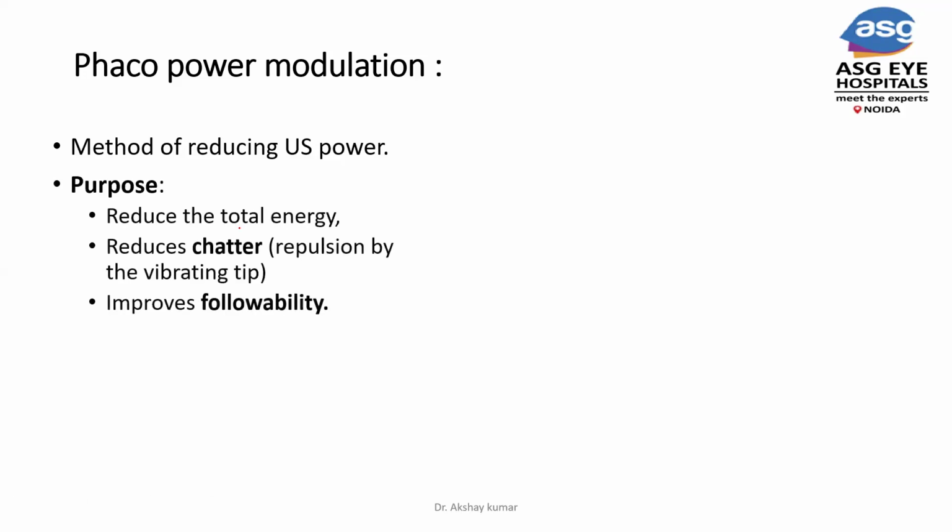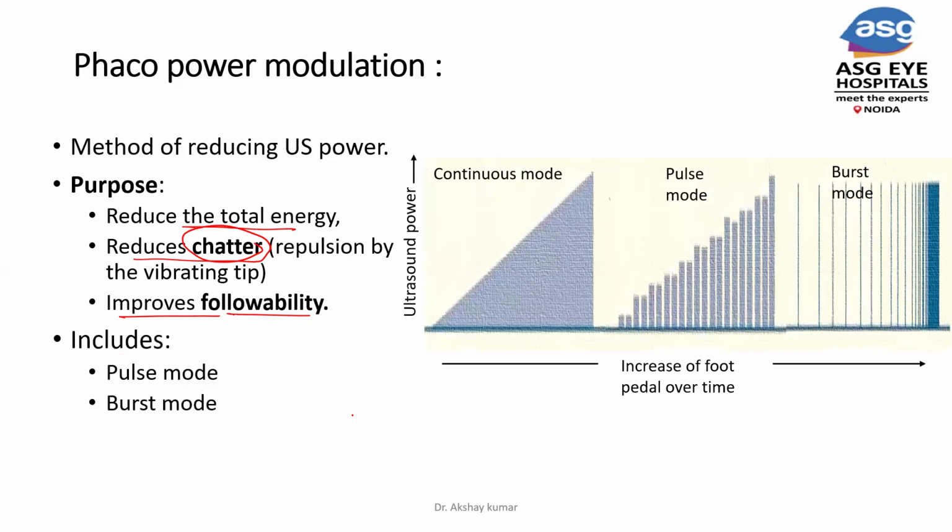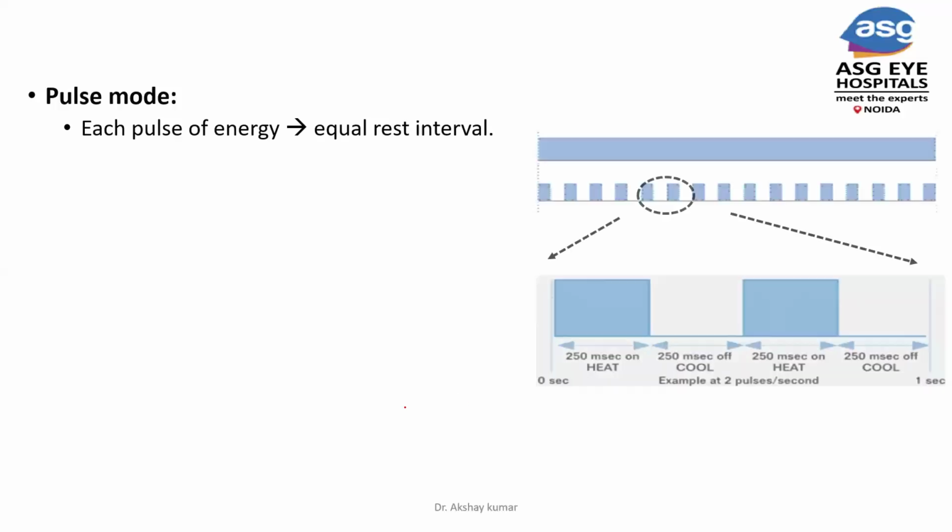So its purpose is to reduce the total energy, reduce the chattering, and improve the followability. So it broadly involves the pulse and burst mode. So what is the pulse mode? You need to understand this.